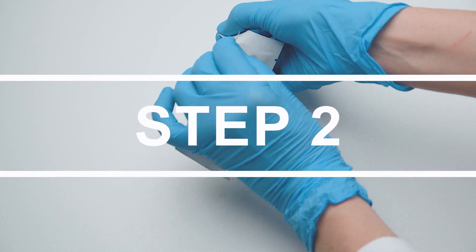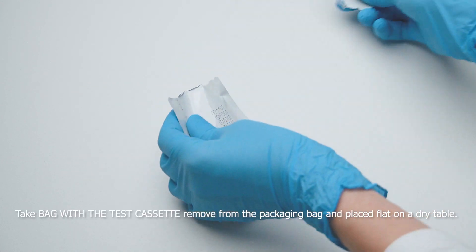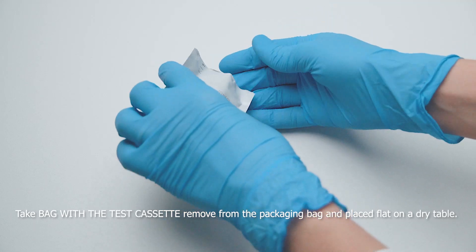Step 2. Take the bag with the test cassette, remove it from the packaging bag, and place it flat on a dry table.